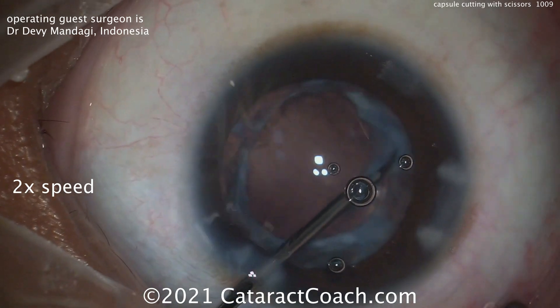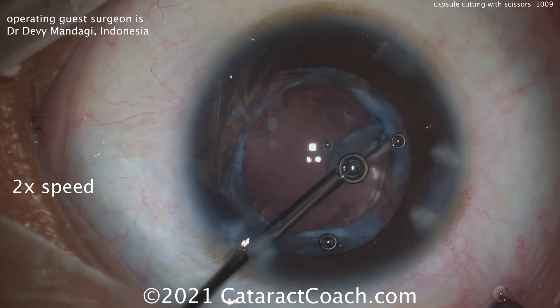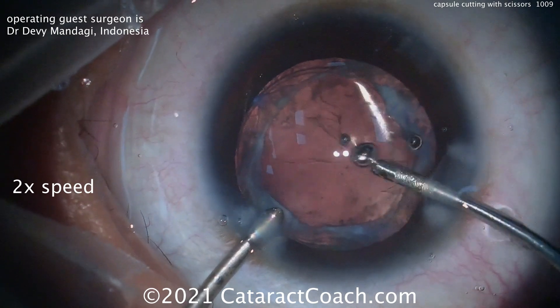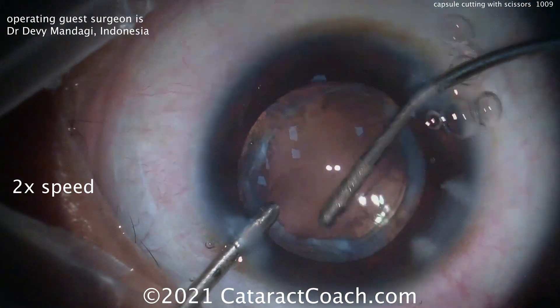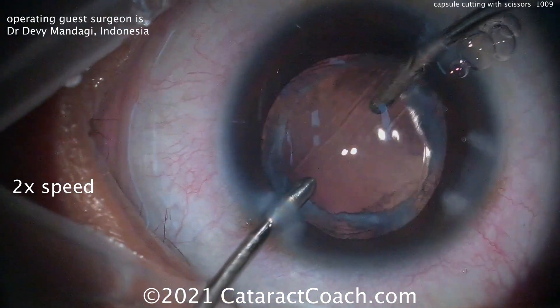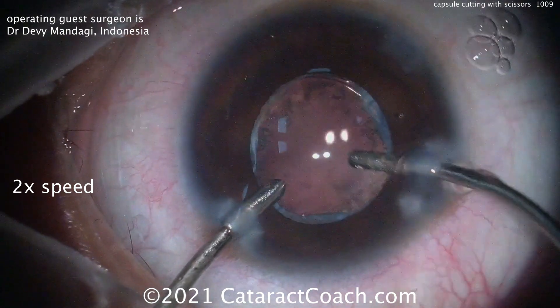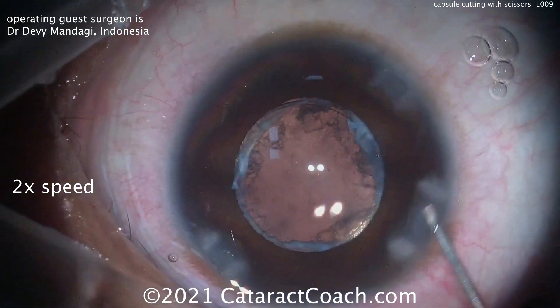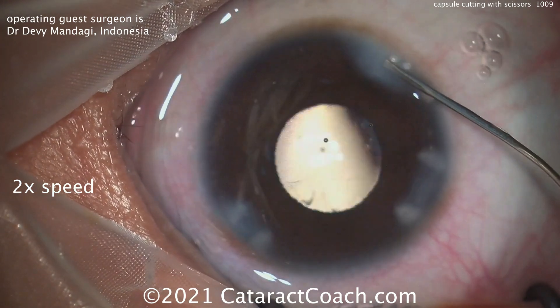That little small piece can be cut further or pulled outside the eye. Once that's done, it's going to be a beautiful result. You're going to end up with a case like this one day — even if you're a beginning surgeon. I've had many in my career, and this is a beautiful technique showing how to solve all the issues in this case. You won't be able to remove all that white hazy material from the remaining lens capsule, so don't worry about it. Look at the patient's before vision and now look at the after vision — what an incredible difference. The patient has a beautiful result with restored vision.